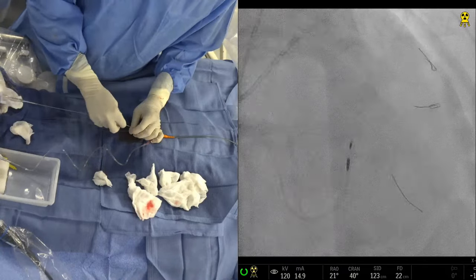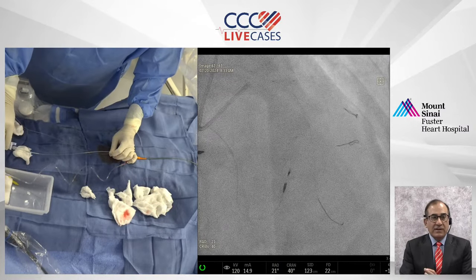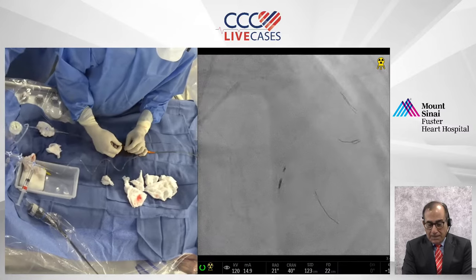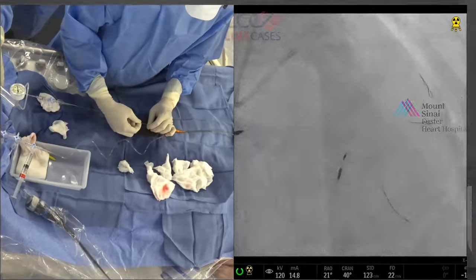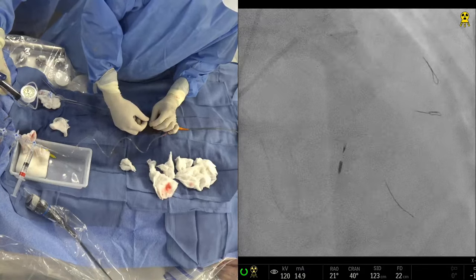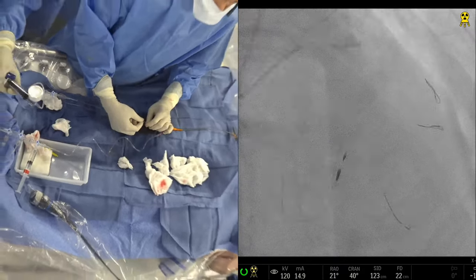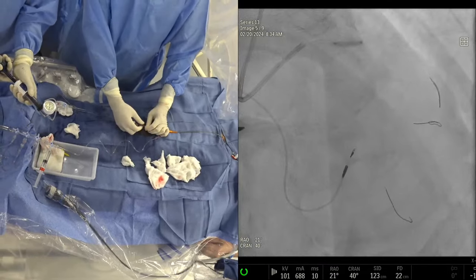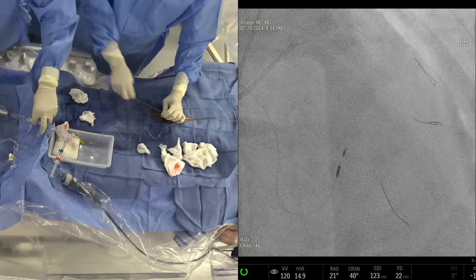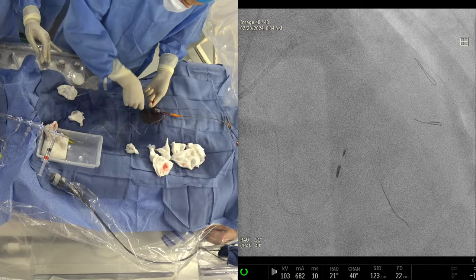The fascinating discussion went on that all the aspects you have mentioned about the greater role of CT become even better when you incorporate FFR. Yeah, absolutely. And actually now the CT also tells you the lesion morphology: is there a necrotic core, positive remodeling. So they're going way beyond in terms of reporting. There is software, HeartFlow, which used to do only CT-FFR. Now they can actually tell the lesion compliance. And we know the type of lesion which creates trouble is the necrotic core and the positive remodeling. So it can tell you which lesion gives you trouble. So not only the FFR, but also the lesion morphology will become part of the routine reporting.